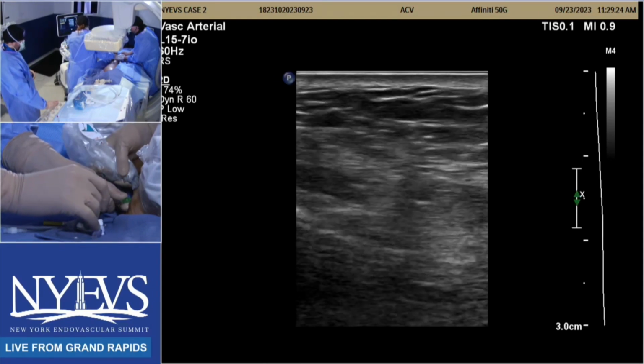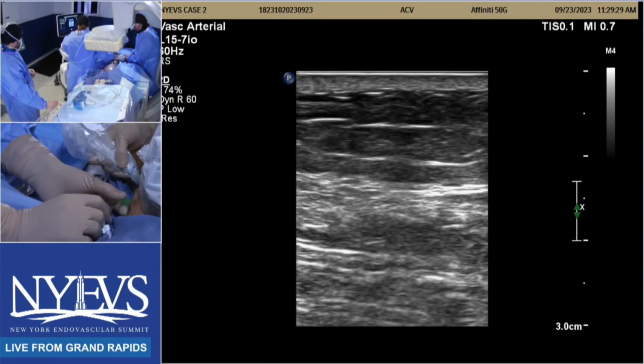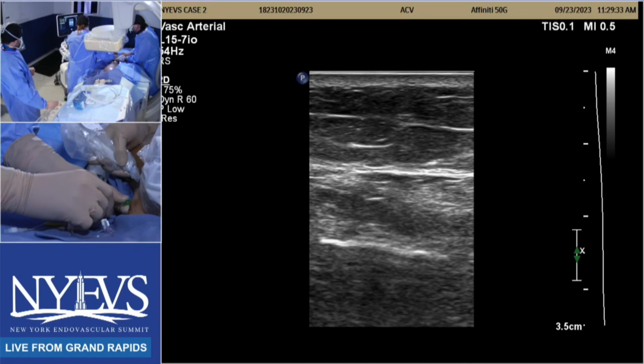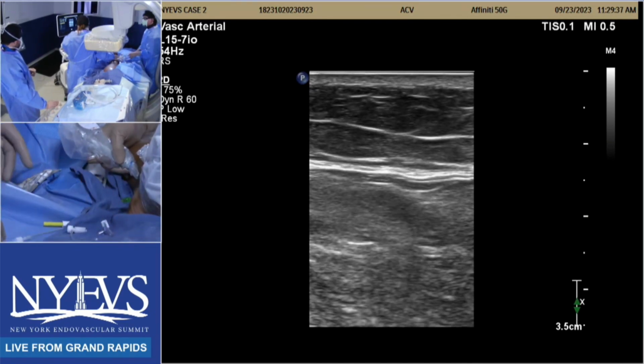And Caitlin is pointing toward the wire. She's basically looking for the straight line between the chunks of calcium because there's dropouts every time we're doing this. So, okay, sorry, can I have lidocaine, please?